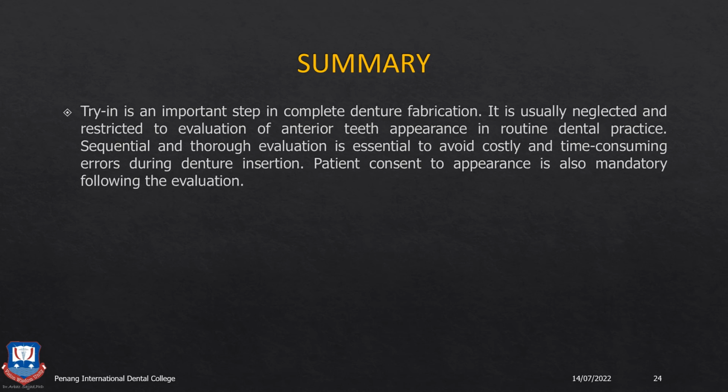So this more or less brings us to the end of this lecture. Trying is an important step in CD fabrication. Many times we neglect it because as soon as we put the dentures in the mouth and the patient is happy, we think our work is done, and we just tell him to bite, and we see okay, occlusion seems fine. The key of occlusion, we check the first molars, and that's it.